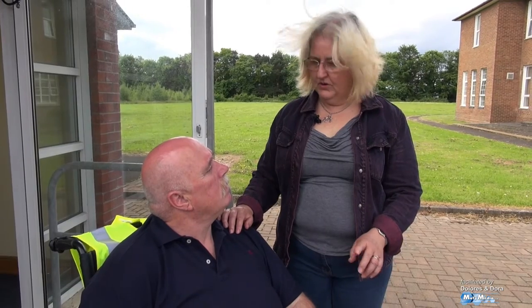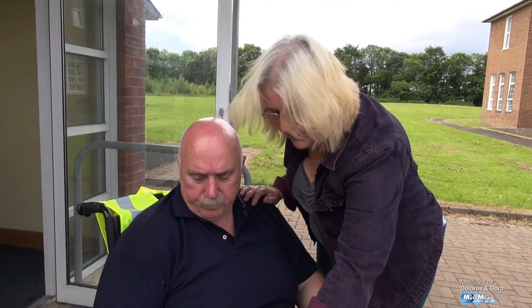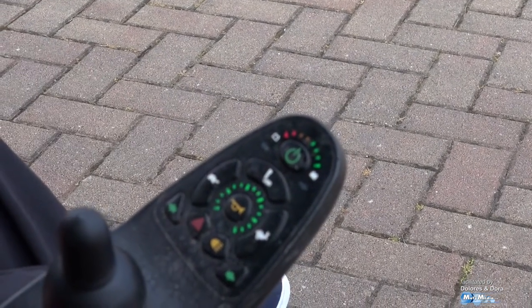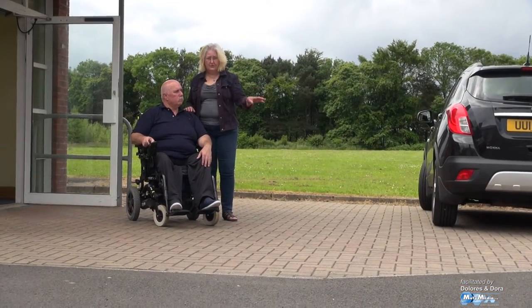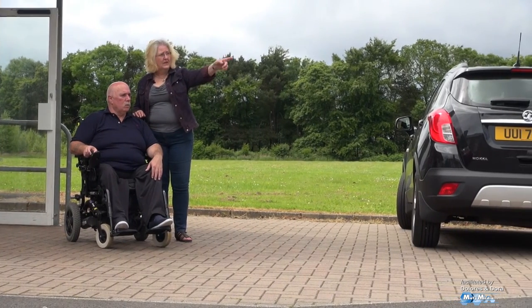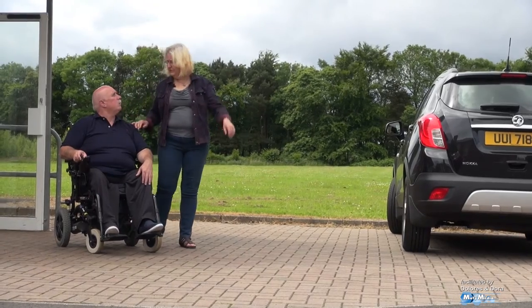David, when we are outdoors, you can take your speed up to four miles an hour. So you just press the lever there and take it to full speed — that's four miles an hour. It's a fast walking speed and that's what you want when you're outdoors. Now David, we're going to proceed into the parking lot. Observe the parking lot — nothing moving. You can go towards the drive and head out near the centre towards the main road.